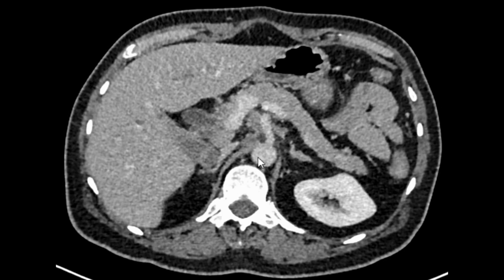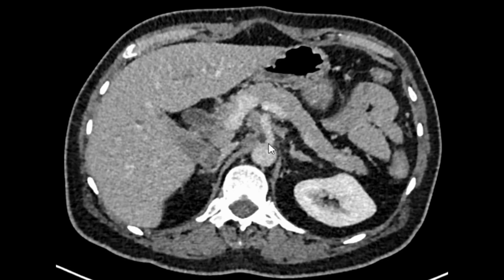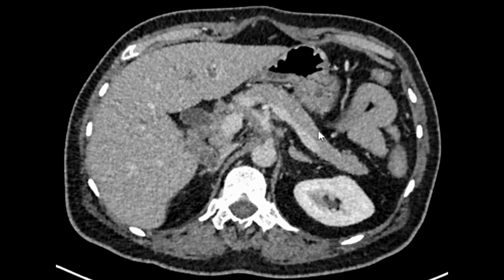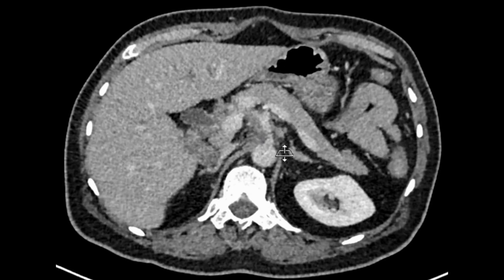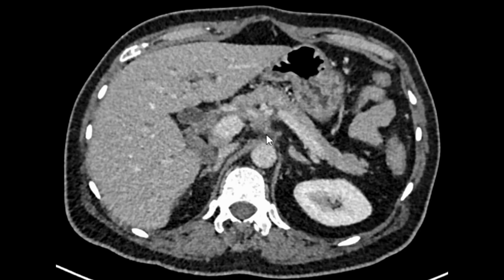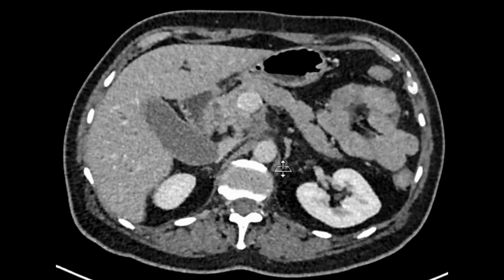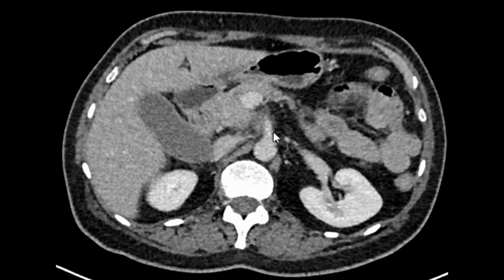There is definitely some soft tissue thickening around the celiac axis. Do you see this low-density area which surrounds the celiac axis as well as its branches? This thickening further extends around the superior mesenteric artery as well. This feature is definitely concerning — it's not a normal finding and not a normal variant either.